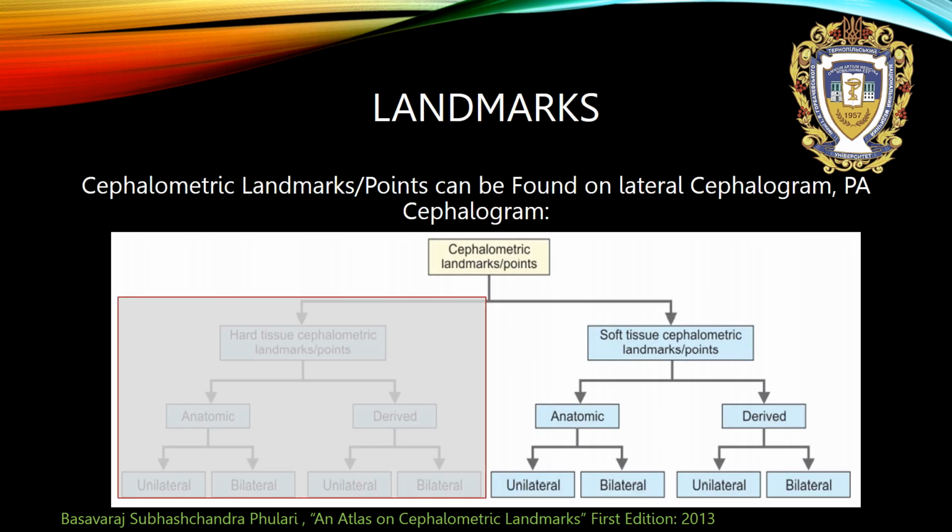And now let's talk about soft tissue cephalometric landmarks. They can be anatomic or derived, and every one is divided into unilateral and bilateral.